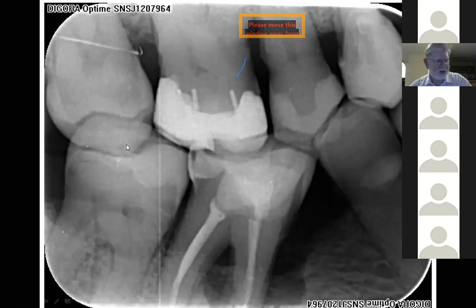Sometimes the exam pack, mirror, probe packet hasn't even been opened. And the student may come up to me hypothetically and say, look, part of a filling's missing on the 7, I want to fill it. You ask the patient to close, and you can see that the reason why that's worn as it is is because of the opposing 7 biting right into it. So this was just hypothetical, but the big issue here, would you do any further investigation radiographically for this patient?